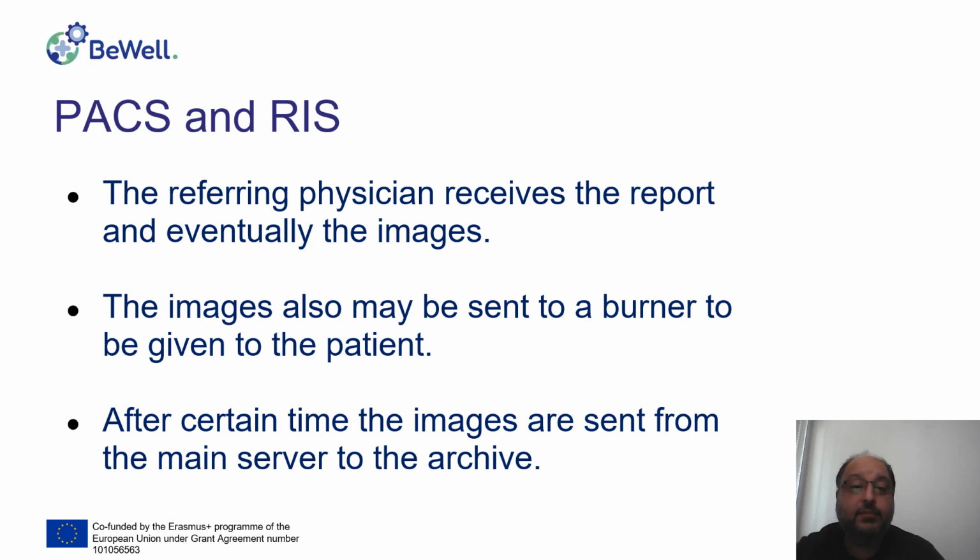And after some time, the images are stored to the archive server. They spend a certain time on the main server. It depends, of course, on the preferences of the healthcare organization and the settings they put. But the normal time is 2 weeks or 1 month. This is the normal time to spend on the main server and then to go to the archive.